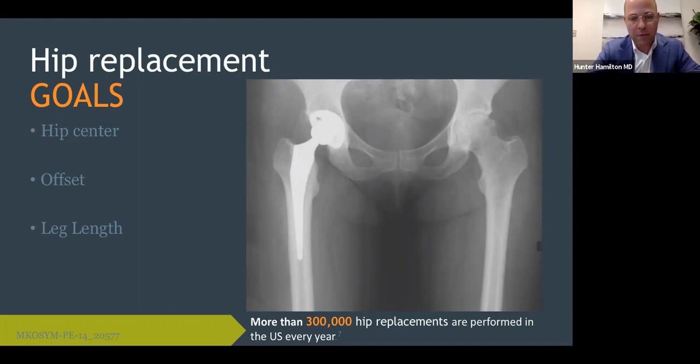And modern hip replacement has been performed over the last 50 years, initially in England and then over in the United States. And it's an excellent surgery. I think overall satisfaction rates are 93%, which begs the question, and the topic of the talk is, why, if it's done so well historically, why do we need to make improvements with adding current technologies? And I hope to convey that to you today.